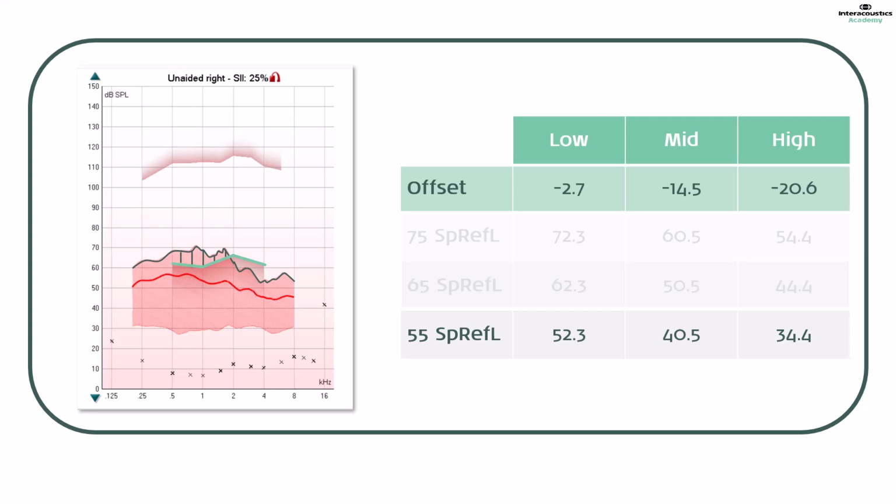Here is the threshold highlighted by the green line. In visible speech mapping, the threshold is shown converted into dB SPL. It is possible to see that some low and mid-frequency content is above the threshold and therefore audible at 55 dB, but the high-frequency content isn't. It's important to highlight that although some of the low-frequency content appears to be audible, it is a very small amount of the full range of speech being spoken within that ISTS presentation.